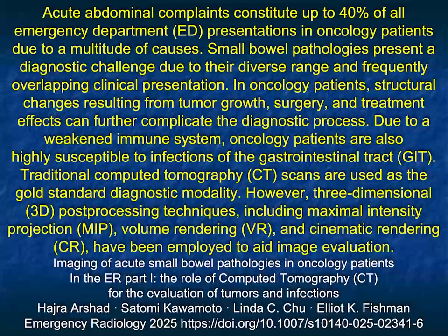I spoke only about the small bowel. I didn't go into the colon and some of its complications. I didn't speak about the spleen. I didn't speak about the liver, the pancreas with pancreatitis, or the adrenal glands, at times with bleed or other complication. So again, think about all the organs. Look carefully at the images. You must look at the axial. You must look at the coronal. And as I showed you, sometimes the 3D can be very helpful. And with that, I'll stop there, and thank you for your attention.